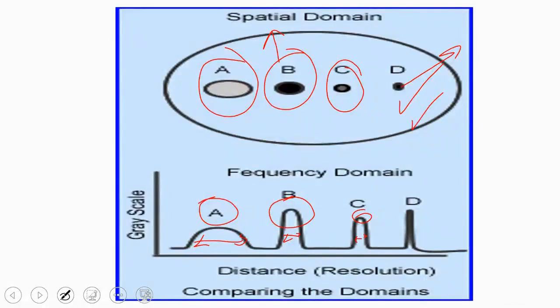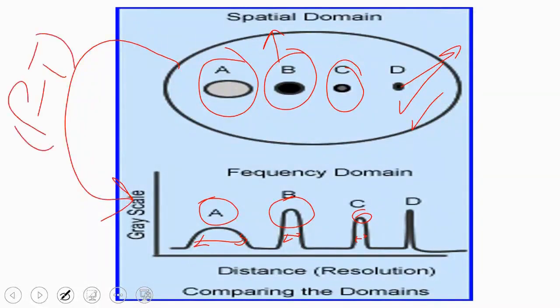It tells you about the transformation from what is called the spatial domain to the frequency domain. This is called the Fourier transformation. This is done through mathematics or through a specific equation that I will introduce. But what I want you to understand is, when you read the terms spatial domain and frequency domain, you have expressed these things inside the patient in a way that is described by frequency. It has amplitude.